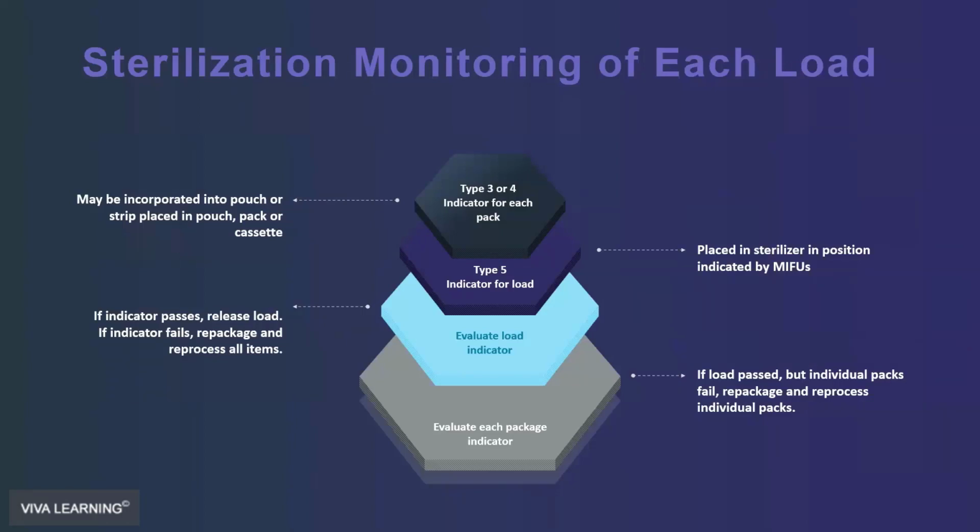And you check it. If it failed, then you send that back to sterilization and you get another cassette of instruments. And I have seen that happen a couple of times in practices when I was there consulting. The first time it happened, the hygienist just absolutely lost it. Oh my God, this failed. Oh my gosh, she's almost hysterical. And like, okay, calm down. It's going to be okay.